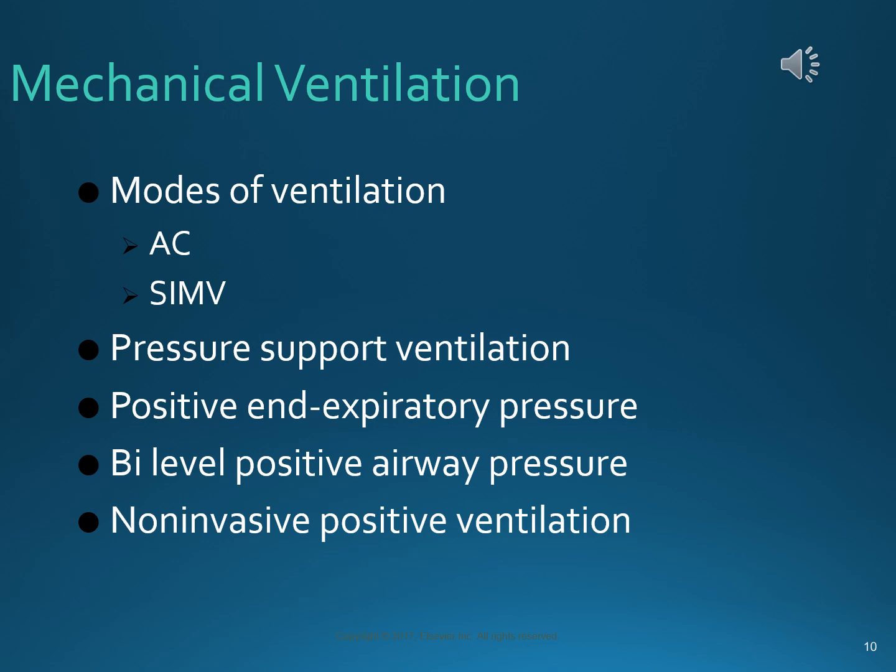And then really, non-invasive positive pressure ventilation is like BiPAP. It's kind of the same thing. It's trying to keep somebody ventilated without intubating them.